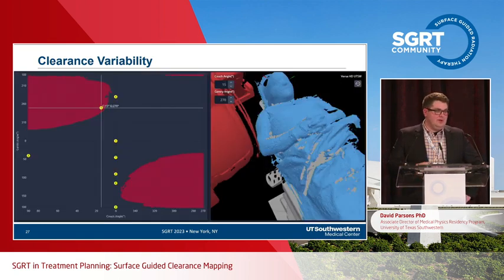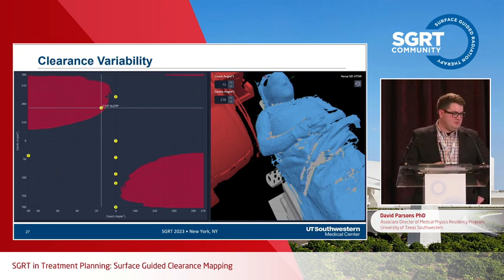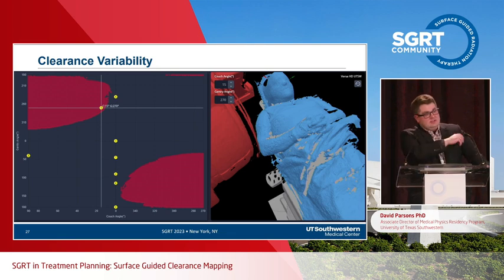But we open up MapRT, select the patient's capture, look at the collision zones, and you can see on the Versa HD, that safety ring that's telling you stop the gantry, you're about to hit the patient, actually would be hitting the patient's arm. In this scenario, you have some wiggle room, you can ask the patient to move their arm, but you can imagine how, if this was slightly more, you may have to abort the treatment and postpone or replan.